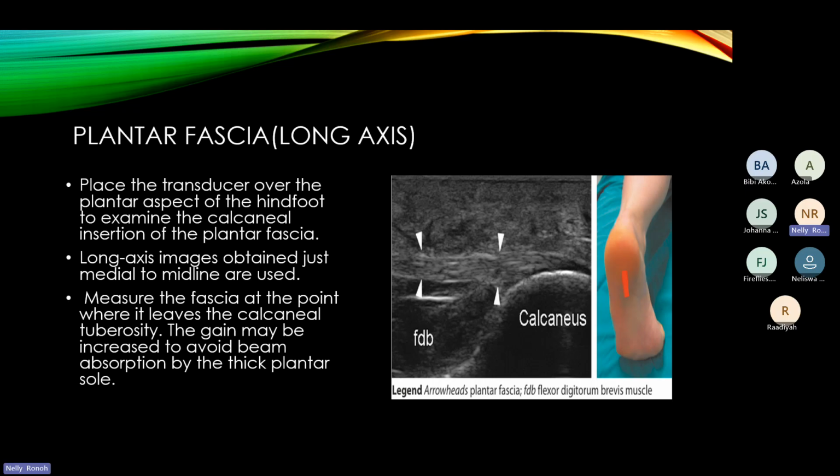fascia. You need to have the patient on their toes so that it actually stretches it out. It makes it more superficial, as opposed to if this patient had their toes hanging, then it means it's even pushing it further because the leg is more curved. Here we are trying to have the foot more parallel and more straight, because remember we said when we are checking, the plantar fascia is the same as the tendon.